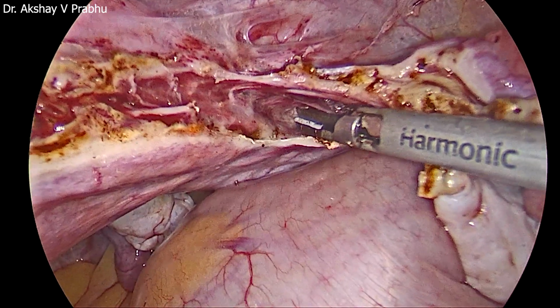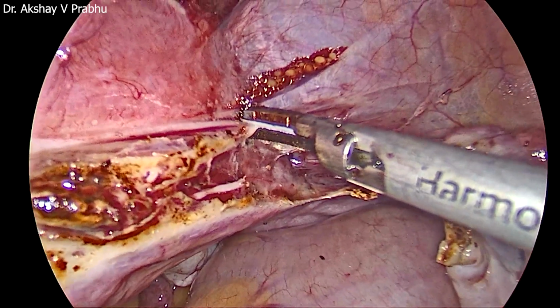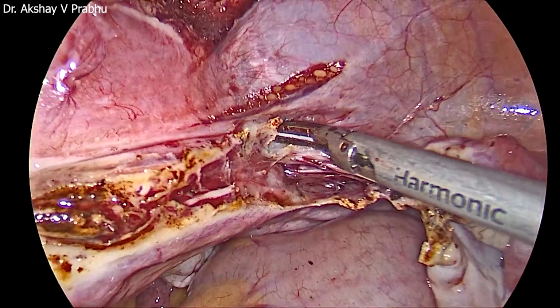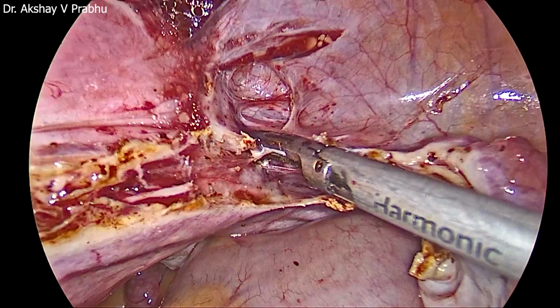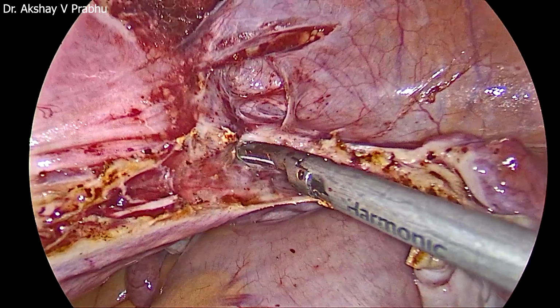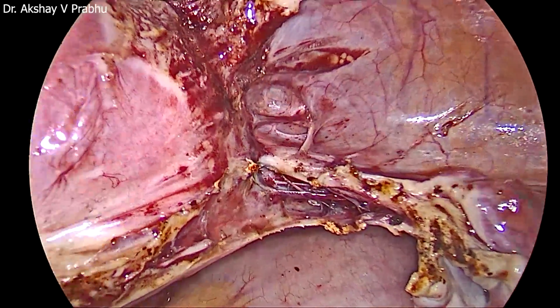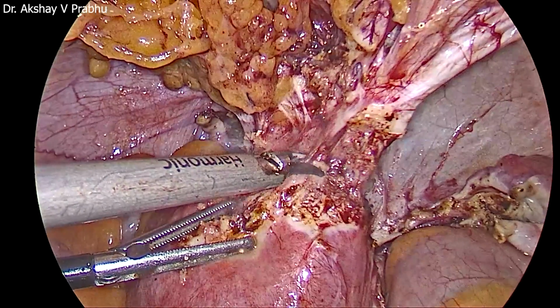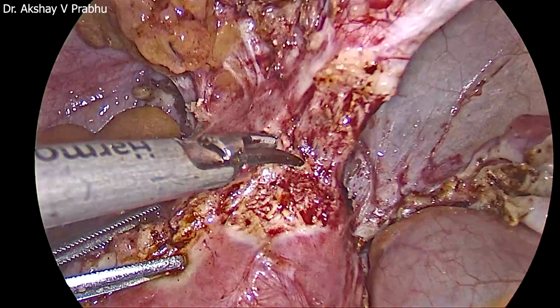Any amount of haste, especially in this step, the worst disaster or the nightmare is going to be if you damage the uterine veins. Uterine artery is still okay because the bleeding will be pinpoint bleeding. They'll be spurting. You can locate the site and cauterize it. But if a uterine vein starts bleeding in this case, it's going to be disastrous because it will flow like anything. Not that it will cause a torrential hemorrhage, but it will cause complete dirtying of the field. After that, no anatomy is going to be visible. The entire field is going to be full of blood, soaked with blood, because of the low pressure backflow which is going to come.